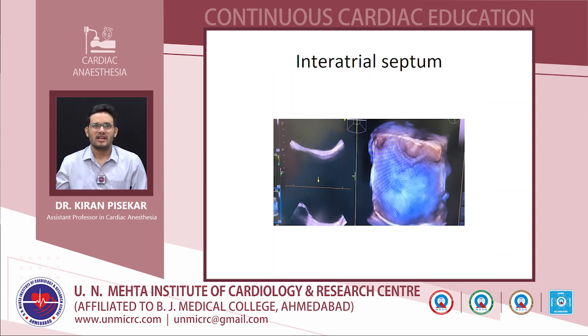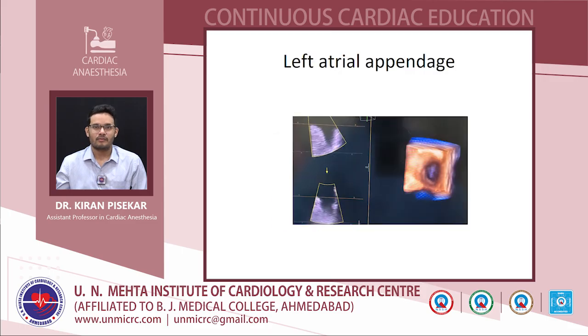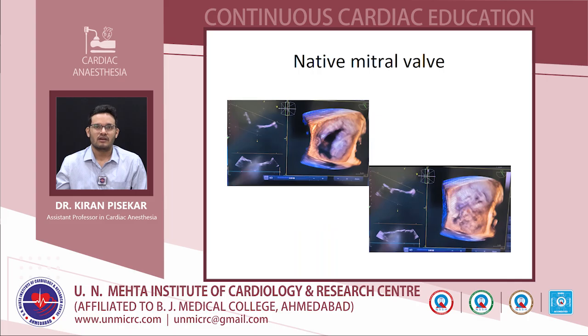So these are the 3D images. This is the interatrial septum. This is the image of the left atrial appendage. Again, if there is any clot, or post-operatively if there is any air, it helps in assessment.